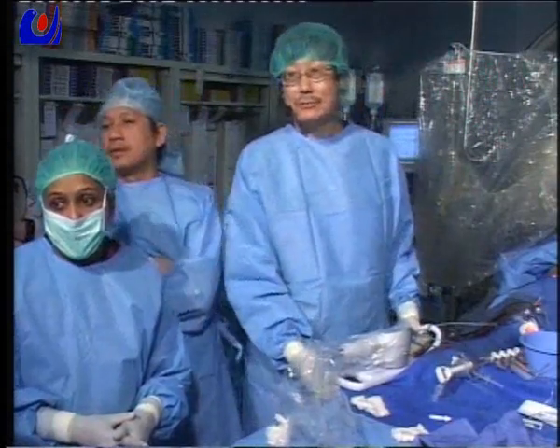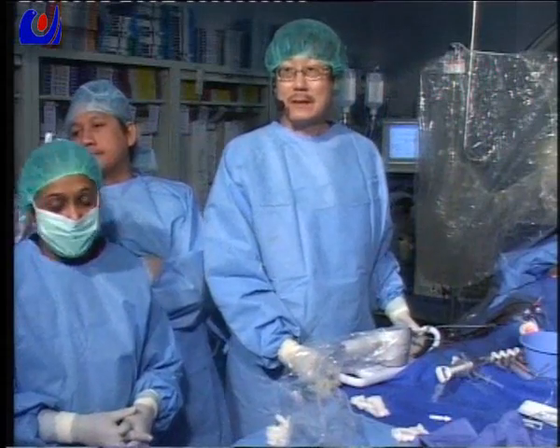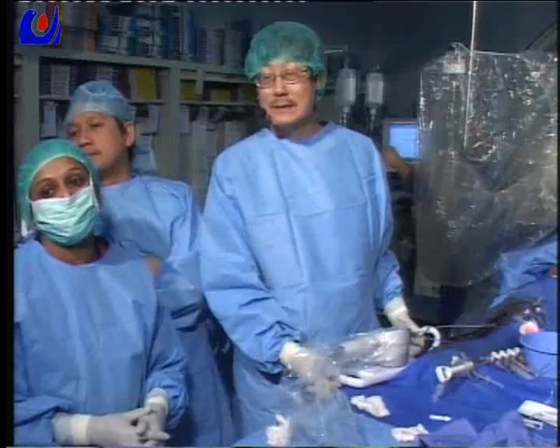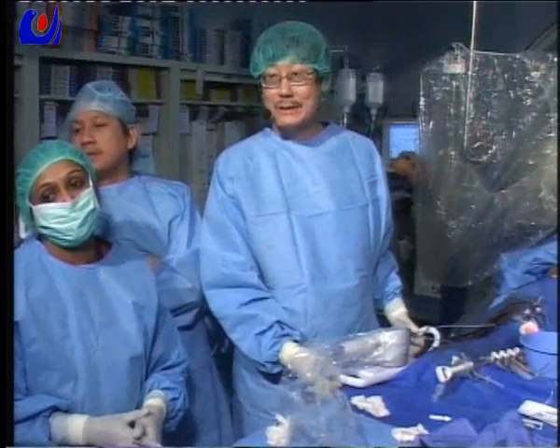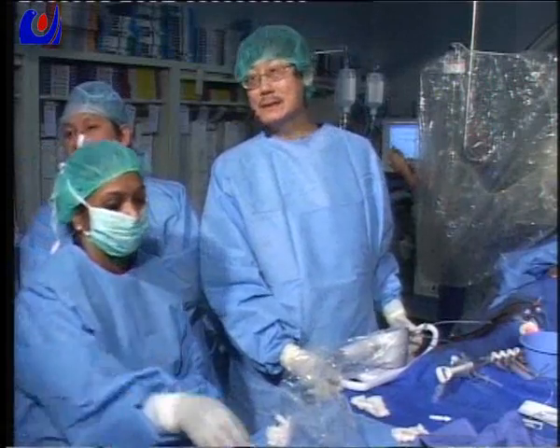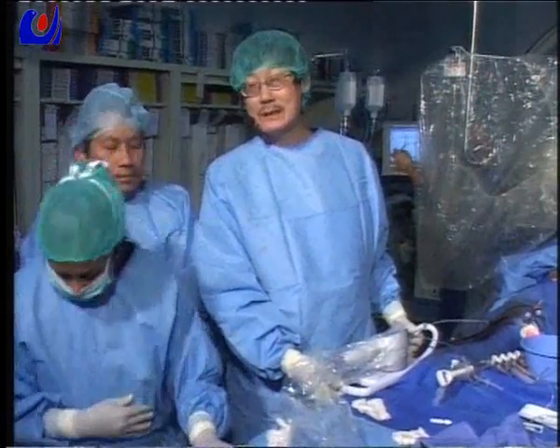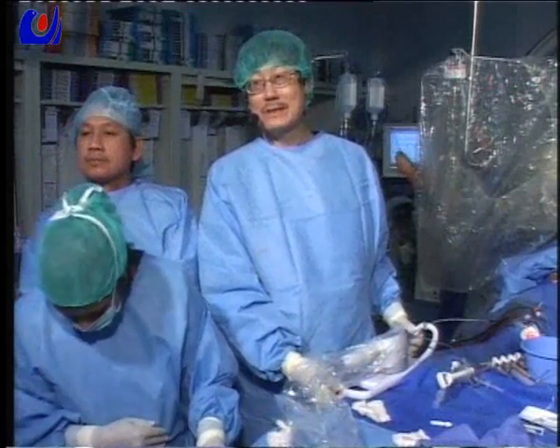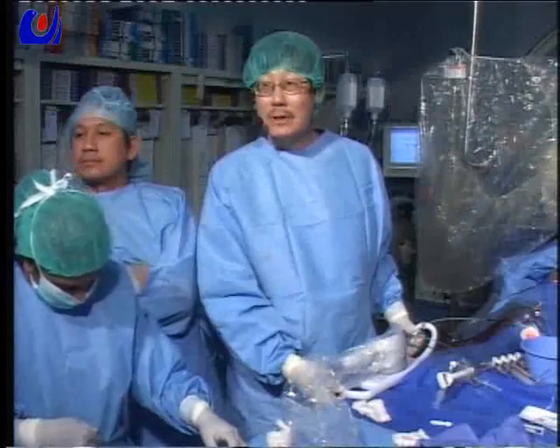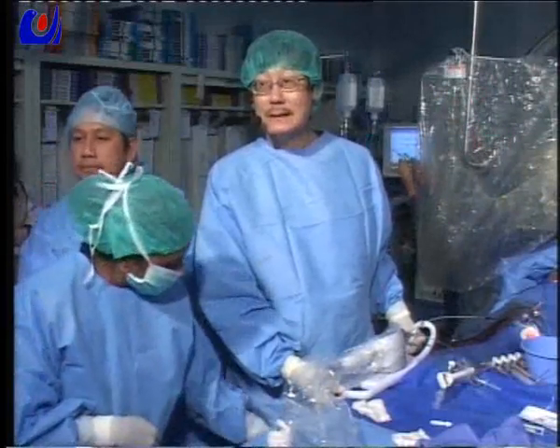And we see two layers now because it's previous bare metal stent in-stent restenosis, and this is the gap between the two bare metal stents, should be at the diagonal takeoff site, and after that we can see additional bare metal stent outside of this newly deployed stent. Okay, this is two layers now.